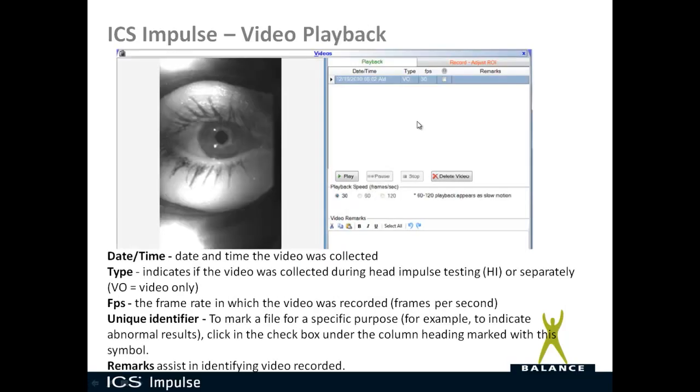On the video playback window, you have a couple of options. For every video collected, you have the time and date that that video was recorded, whether that was recorded under video only mode, or if it says HI, it was recorded under the head impulse mode.